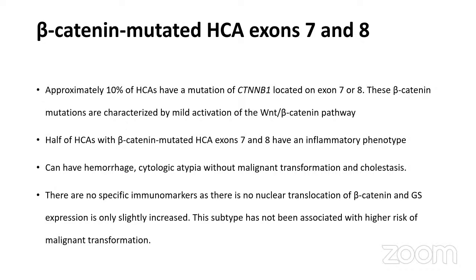And half of these beta-catenin exon 7, 8 adenomas have an inflammatory phenotype. So approximately half of them would have the inflammatory phenotype, and then they would have the sinusoidal dilatation and inflammation, which you would see with the inflammatory phenotype.